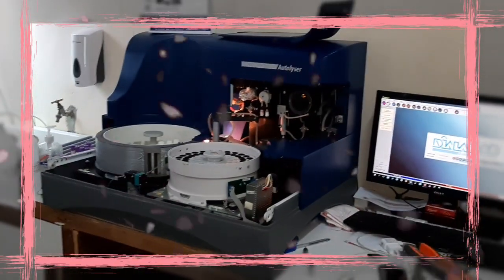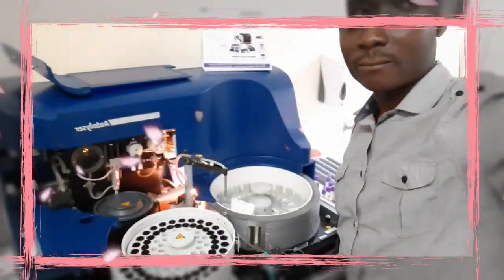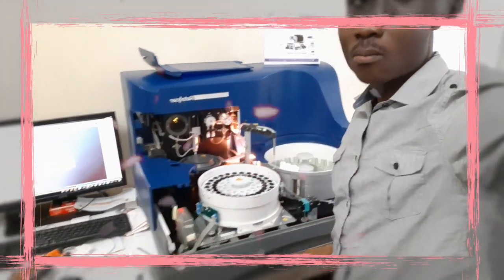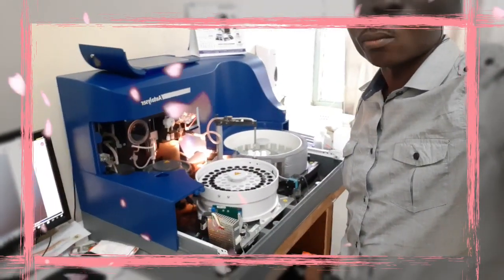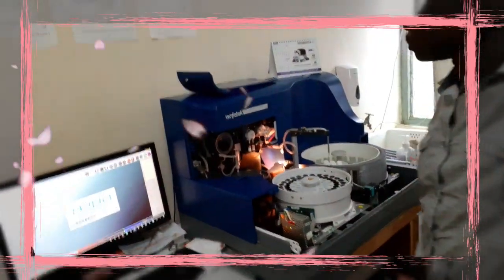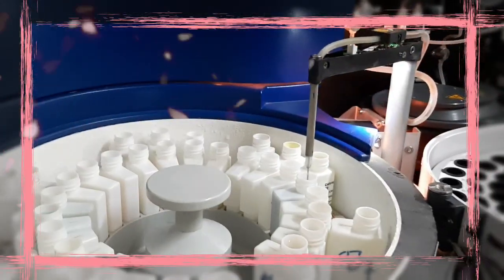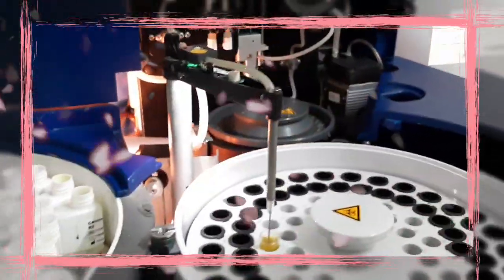It has a sample tray having about 78 total positions with 62 spaces for sample, so you can actually program about 62 samples on board and just run all of them together. And we have 16 spaces for standards and control. It has a reagent tray with 48 reagent positions, which is made of 24 50 millilitre or 80 millilitre bottles, and then 24 10 millilitre or 20 millilitre bottles.